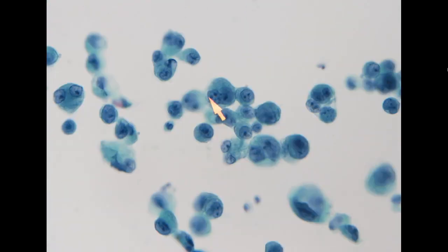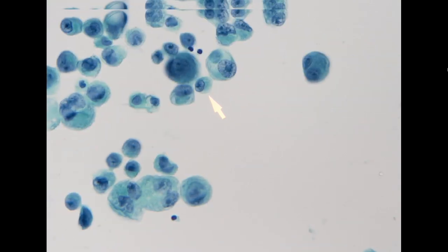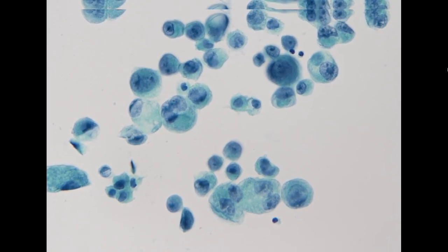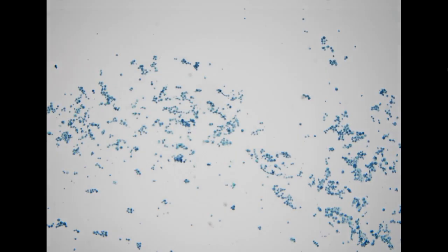So this is classic for metastatic adenocarcinoma. And there is almost no benign mesothelial cell in the background. Everything looks like a cancer cell. So this is in the scenario of recurrence, like advanced stage disease.